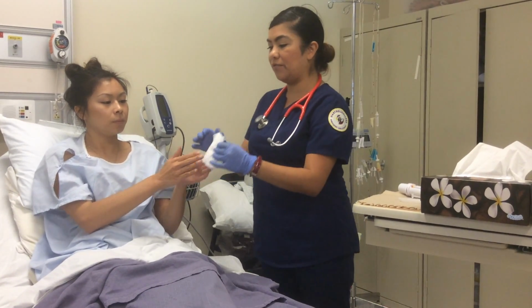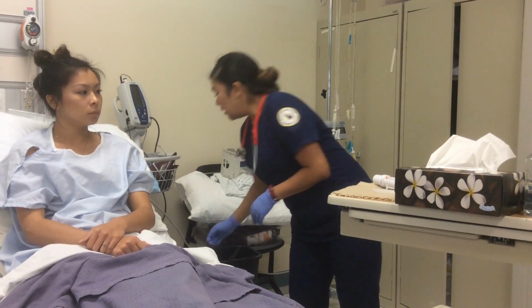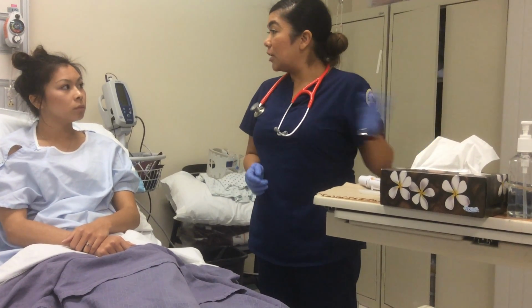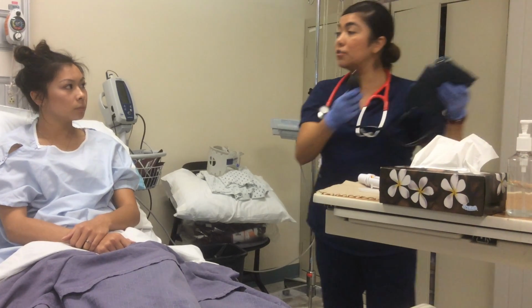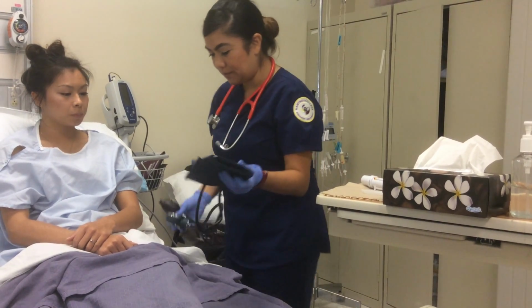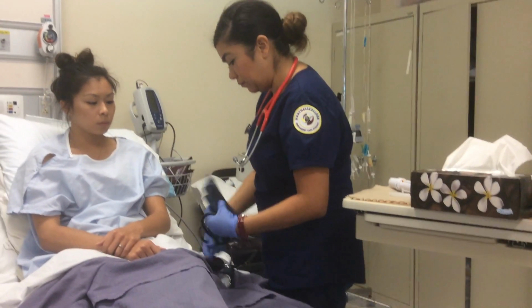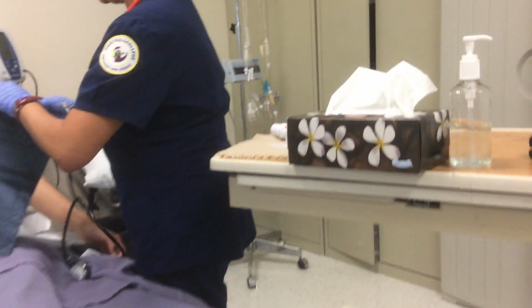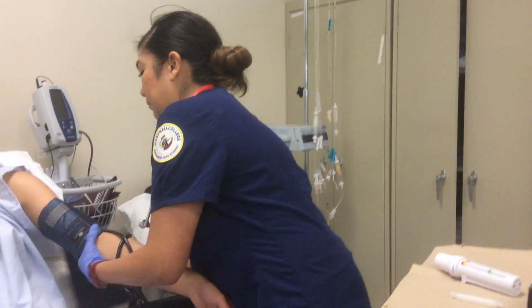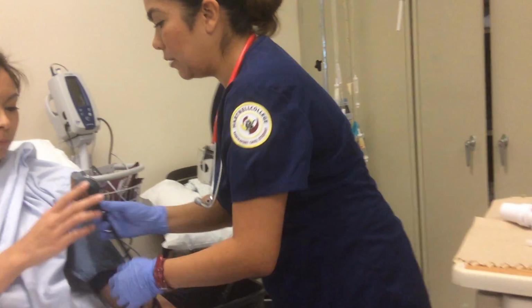Very good. Perfect. Very good. That's a good one. Nice and clear. Okay. So now I'm going to go ahead and check your blood pressure again. Do you have any questions for me so far? No? Okay, thank you. I'm just going to ask again if you could go ahead and hold this for me, please.